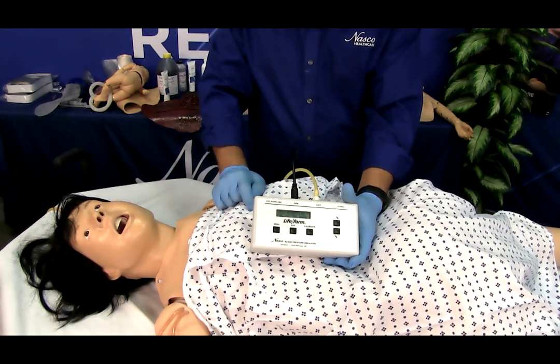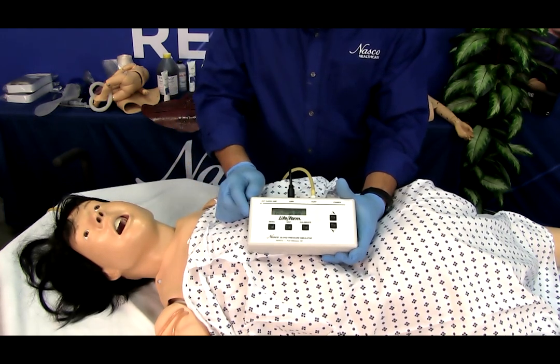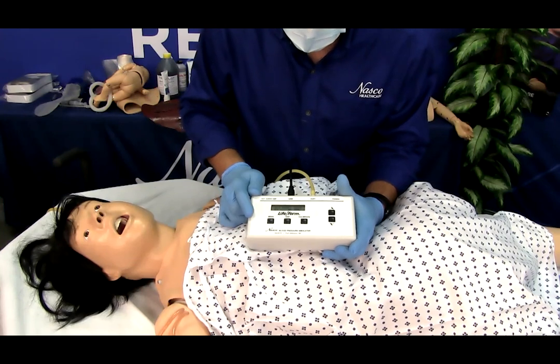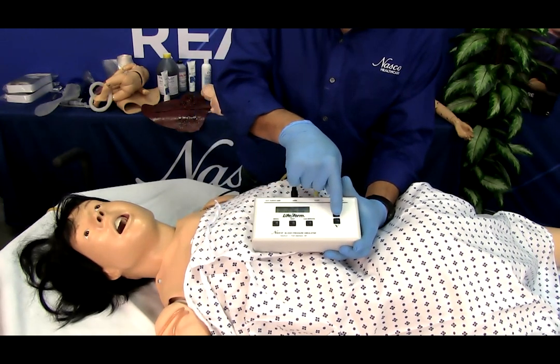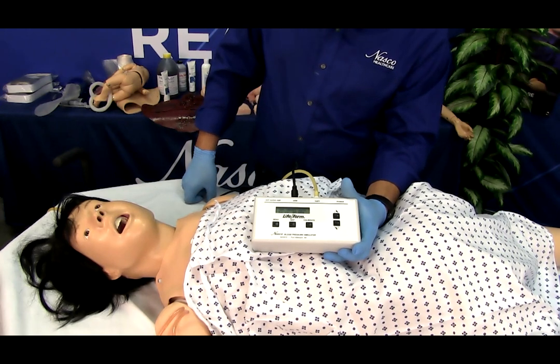To set the heart rate, press the menu key a third time. The Set Heart Rate menu will display in the electronic control unit window. Use the up or down keys located to the right of the menu button to adjust the heart rate. The heart rate can be set from 0 to 300 beats per minute.